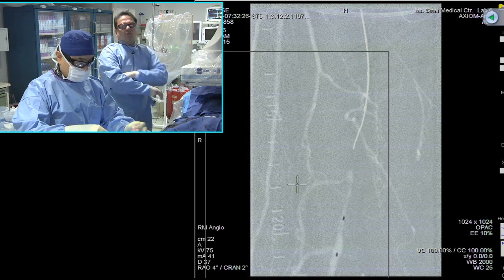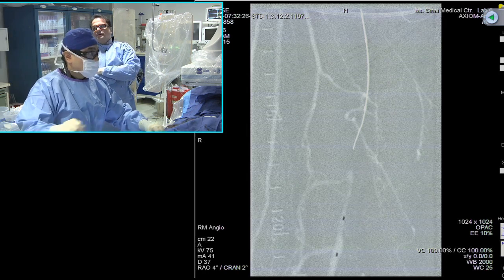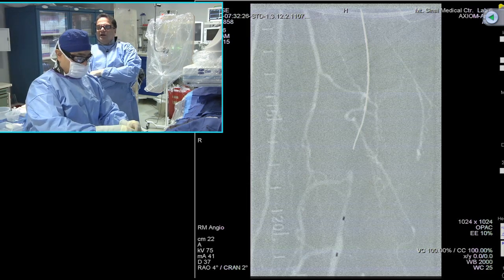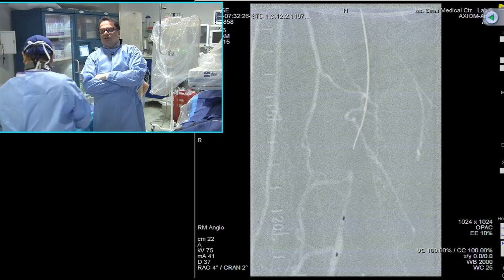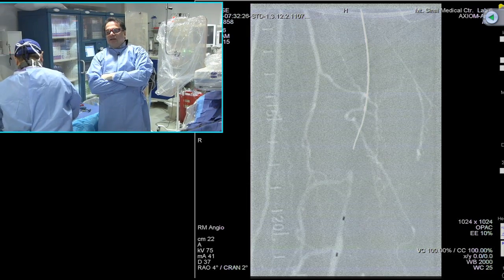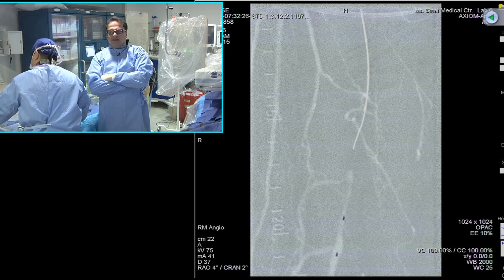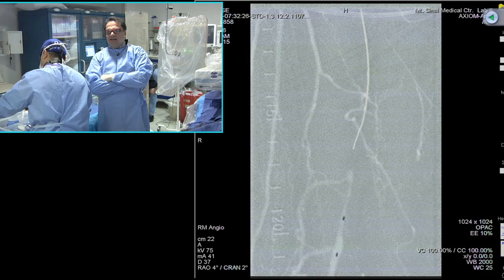So we're going to use a bare wire here because we've got our catheter down there. And then we're going to use a 4/7 Abbott filter, and then we're going to do a rheolytic thrombectomy, followed by which we'll come back live to you. In the meantime, let Sachin go ahead and present the case. I'll present the data that we have prepared.